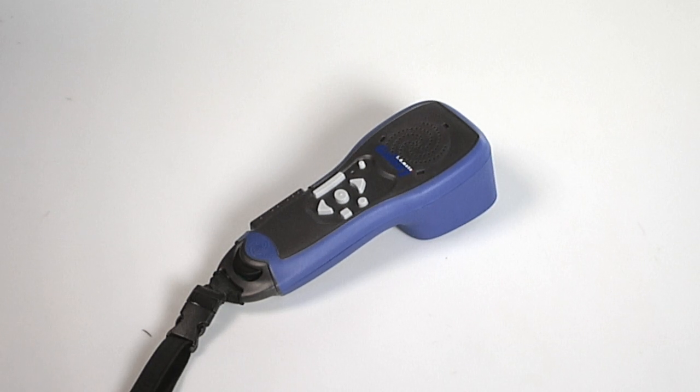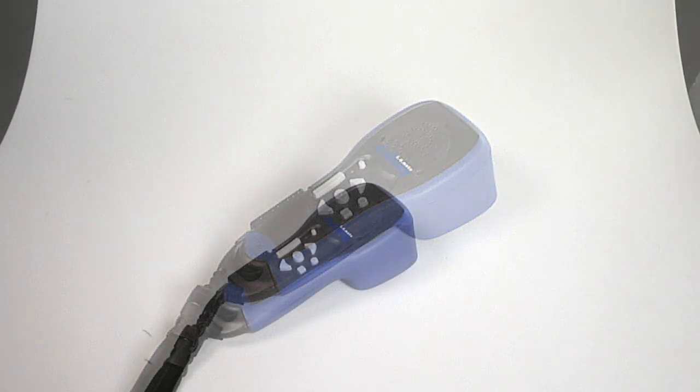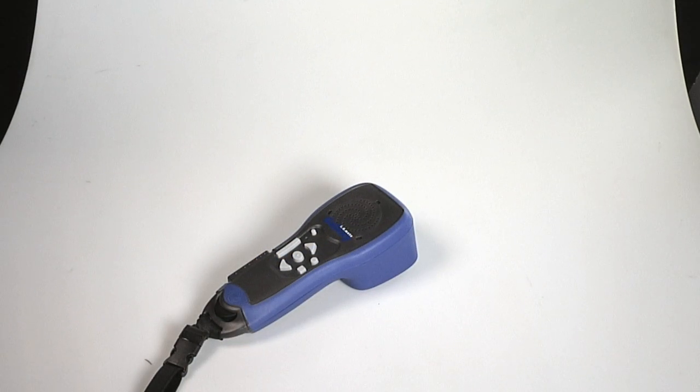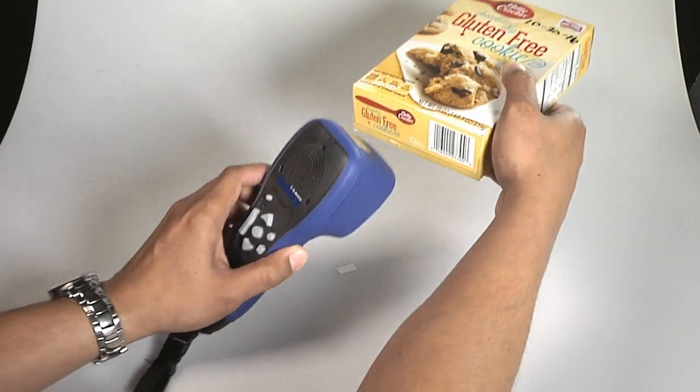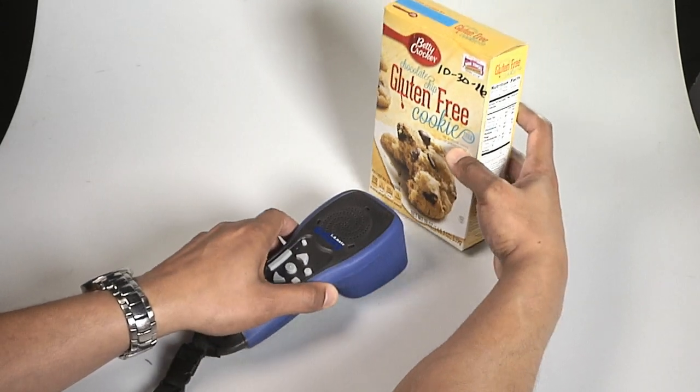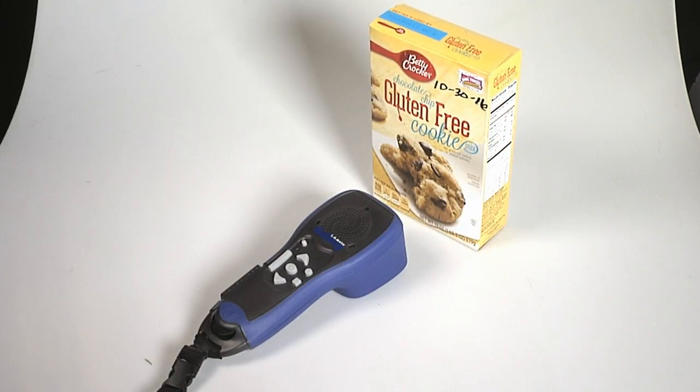You will need to wait until ID mode is heard to scan a barcode. At this point, a red laser will appear underneath the device at the end furthest away from you. Scan the red laser across the barcode to identify the product. Product: Betty Crocker gluten-free chocolate chip cookie mix.